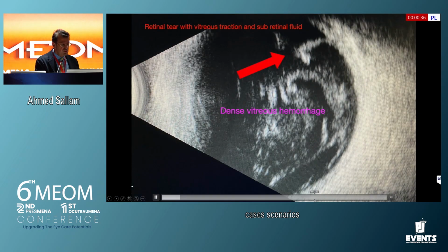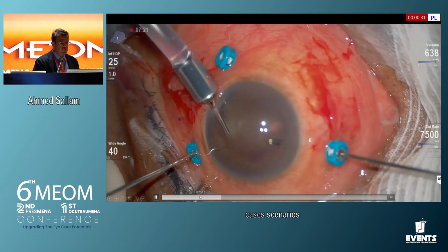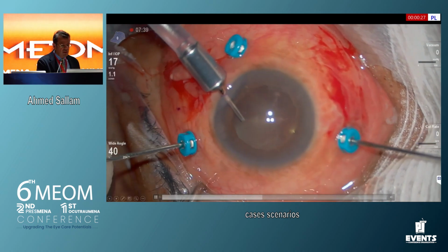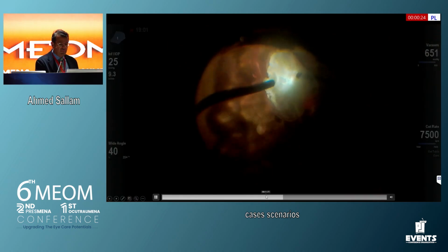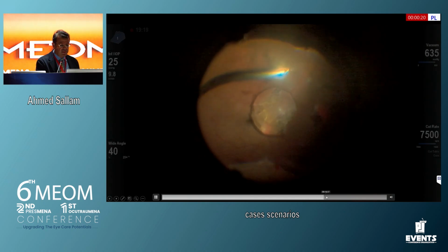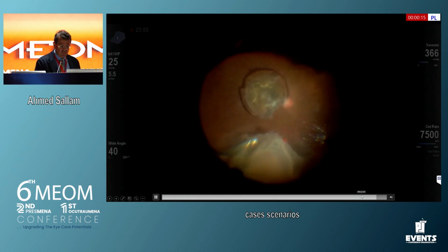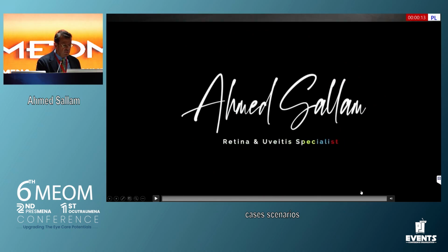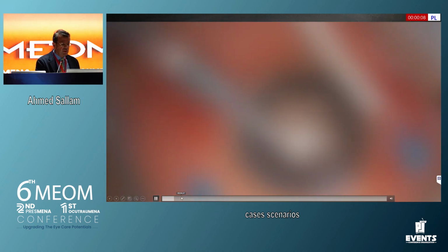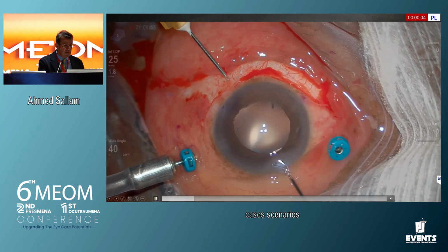This is another case. I just want to show you another way of repair. This is in a context of vitreous hemorrhage, vitrectomy, and hypotony because of cyclodialysis. So here, this patient also had a dropped lens from the trauma, and he had a giant retinal tear as well, which you'll see in a minute, just to make things more difficult. So after repairing the vitreous and removing the lens, we mark here the area of the cyclodialysis.